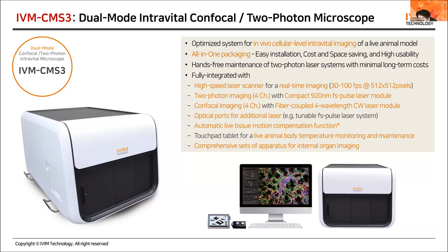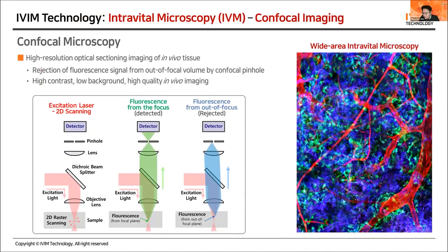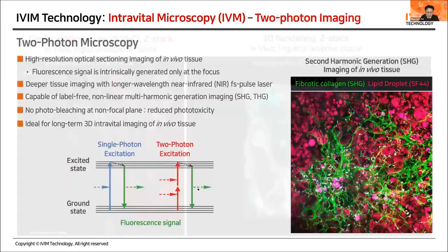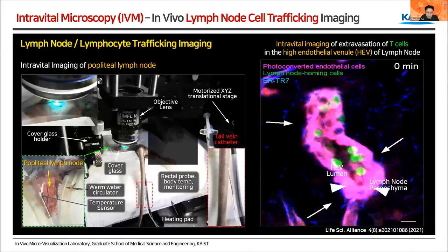And then, is it always necessary to implant the observational window? No, not really. In many examples, if we need to image just one organ at a time, then the imaging window is not necessary. The reason why we need the observation window is to find the same location again and again, like the pancreas, for example.